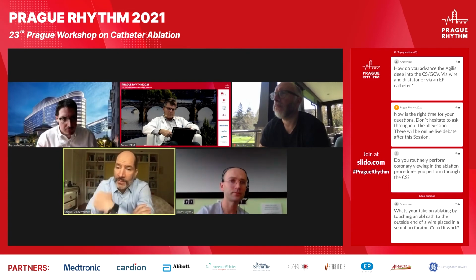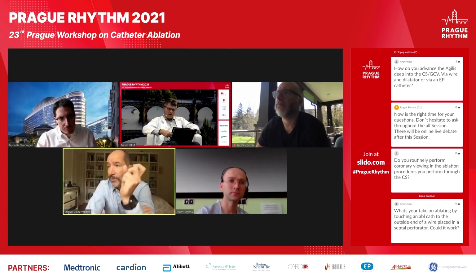So you put your EP star catheter, your octopolar, deep in a septal, and it turns out that the best signal is right at the very beginning of that septal perforator. Then it becomes really hard to make sure the alcohol gets localized to that portion of the very beginning of that septal. You can sure block that septal with a balloon, but then how do you inject it?